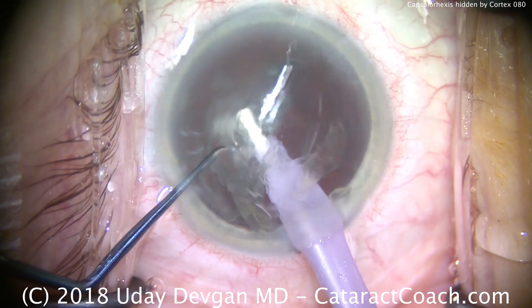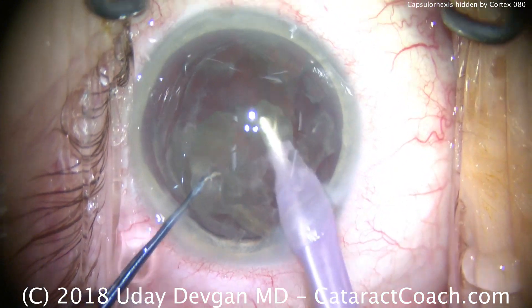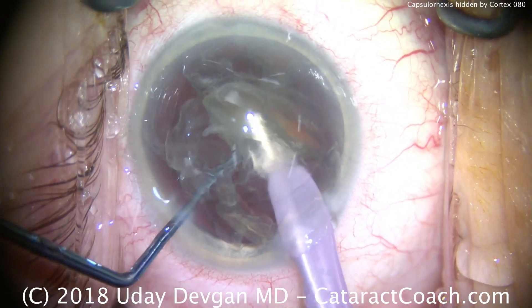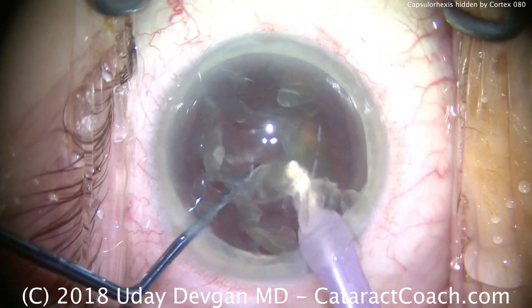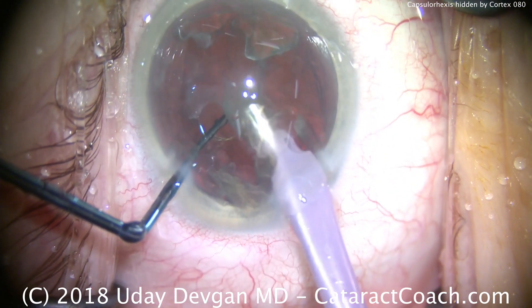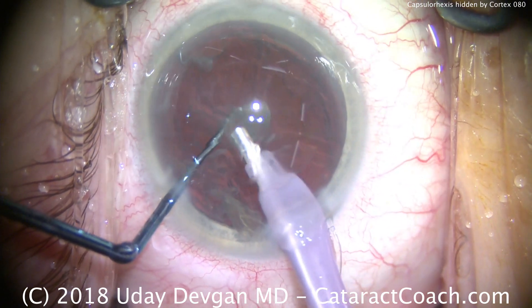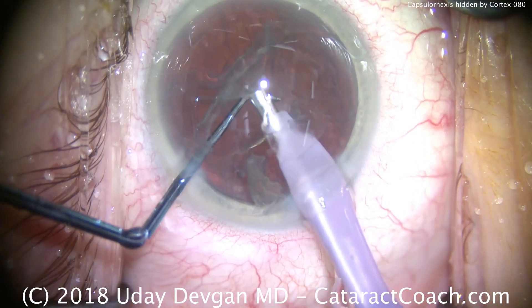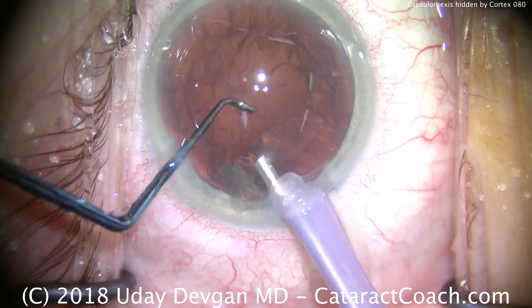We bring up the cataract pieces just about the iris plane. The chopper goes around for an additional chop, and the job of the chopper is to push the cataract pieces in front of the phacoprobe. You don't want the pieces to go in the subincisional space or underneath the phacoprobe — it should be at the iris plane in front of the probe. The chopper is placed in the protective position, because with all those cortical opacities the view is not the greatest, so we want to protect and make sure the posterior capsule doesn't come up. There's a little bit of the epinuclear shell — we take that out, and now the view improves quite a bit.